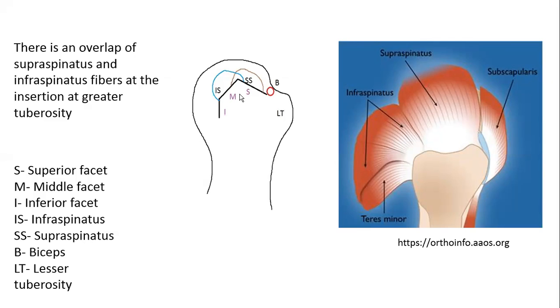And so it is true for infraspinatus. When you're scanning, you want to make sure you're going from anterior to posterior, and especially when it's a normal study, make sure you're not getting the only image of the long axis at this junctional area where there is crossover of the fibers. Going from anterior to posterior, right after the long head of biceps tendon, you start to see the anterior portion of the supraspinatus.